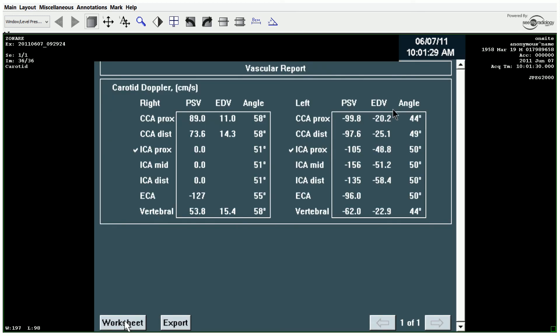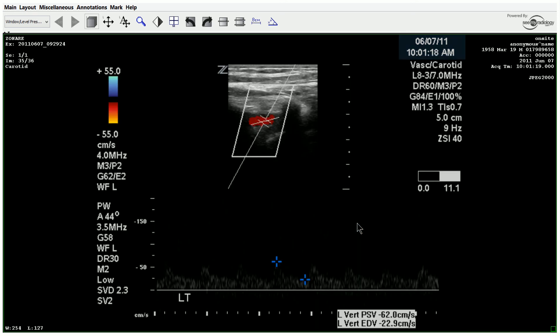Otherwise, the left side is pretty normal as far as the visualization of the vessels and the color flow. The spectral Doppler is increased, but again — can't say it enough — that's just compensatory flow due to the contralateral occlusion.